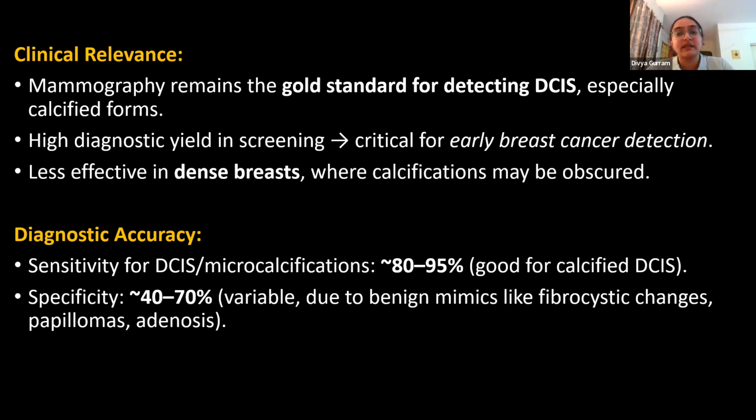So in such settings, it's important that we do careful correlation with ultrasound or MRI for a complete evaluation of whatever subtle findings that we have picked up.